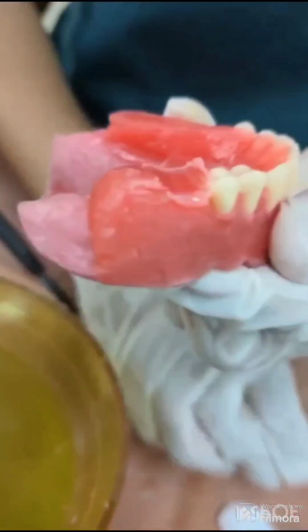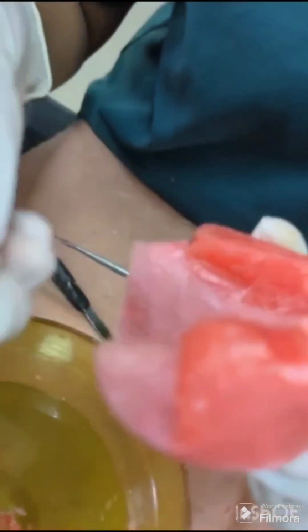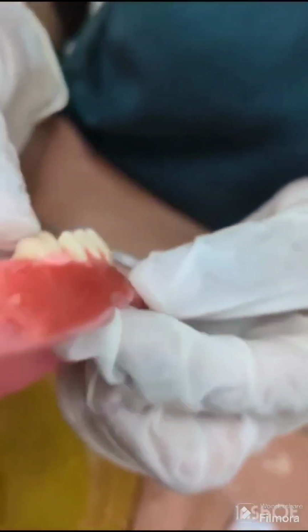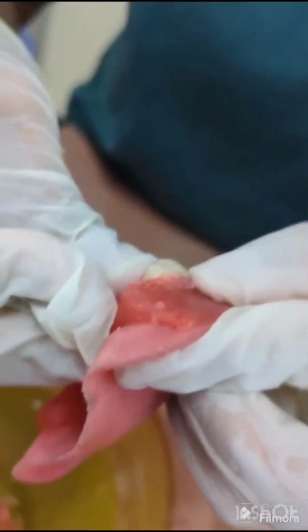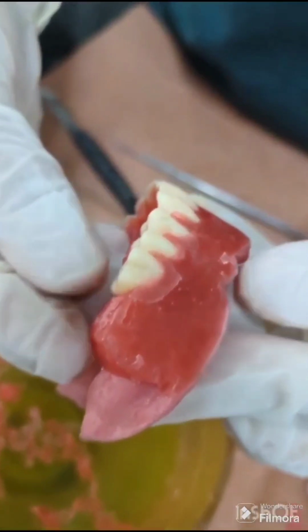Only the mesiopalatal cusp contacts the occlusal plane and the mesiobuccal cusp is close to the occlusal plane. From occlusal view, the buccal surfaces of the two premolars and the first molar are in line with the labial surface of the canine.